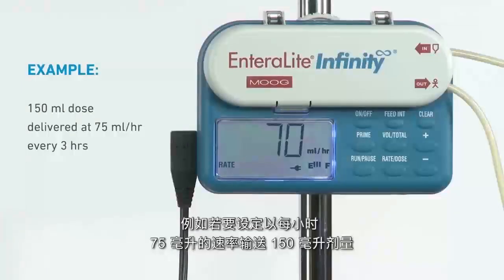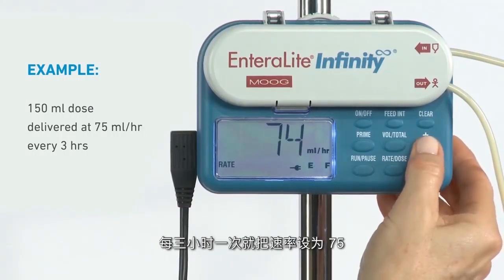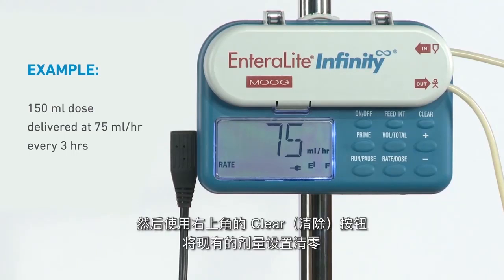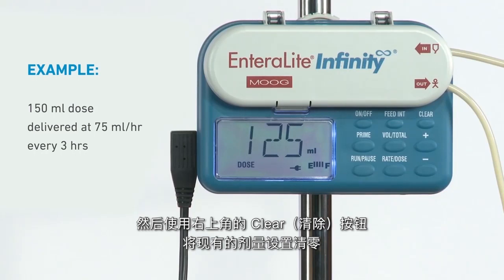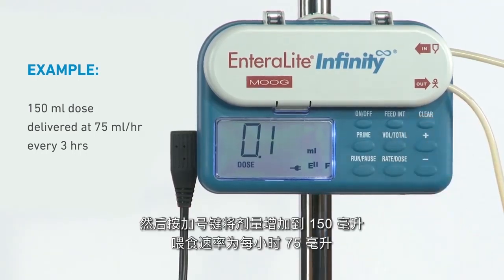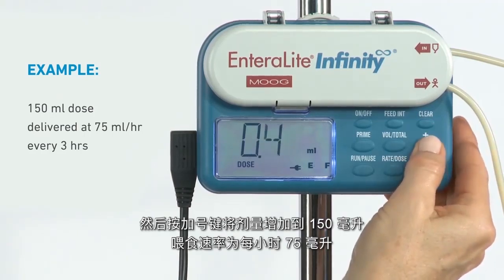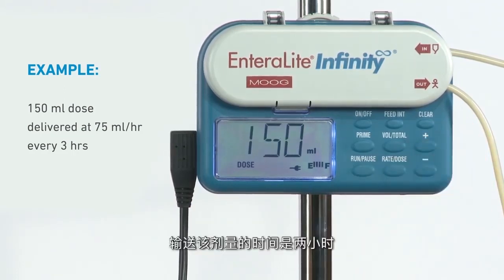For example, to program a 150 milliliter dose delivered at 75 milliliters per hour every 3 hours, set the rate at 75. Then use the clear button in the upper right-hand corner to zero out the existing dose setting. Press the plus key to increase the dose to 150 milliliters at a feeding rate of 75 milliliters per hour. The time to deliver that dose is 2 hours.